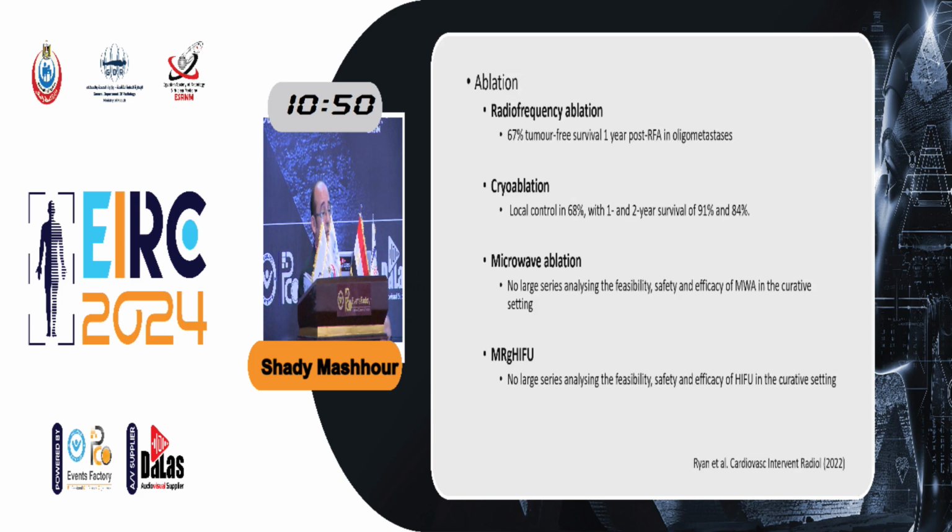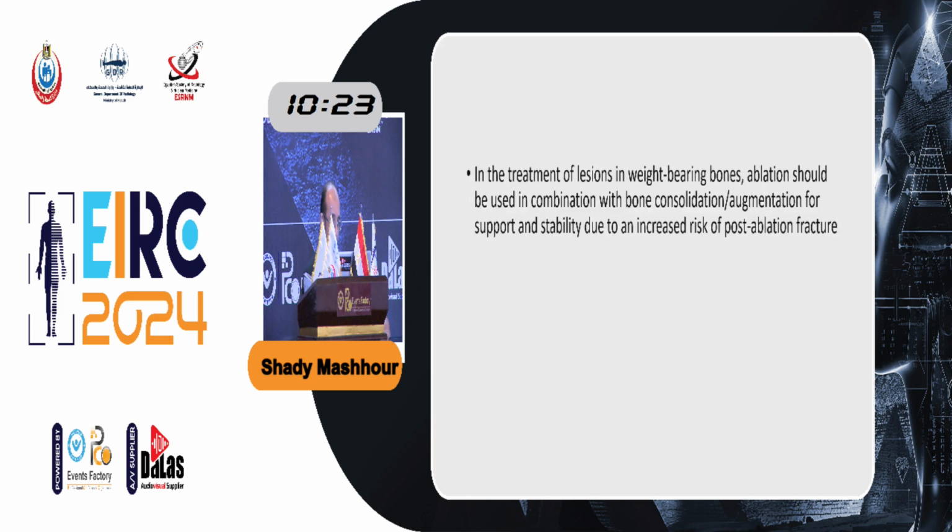The most common device available is the radiofrequency ablation, which is present in Egypt. The cryoablation, unfortunately, is not there. The survival rate is almost equal between them. So there are some differences. Cryoablation causes less pain, however, it's more expensive. And the microwave ablation, unfortunately, there's no large-scale series, unlike the radiofrequency and cryo. And the MR-guided HIFU is what we call a new tool or new kid on the block. Again, there are no large series about MR-guided HIFU in the curative intent.